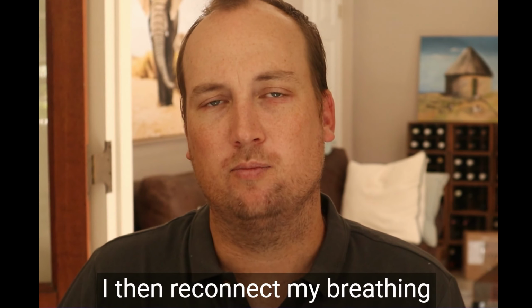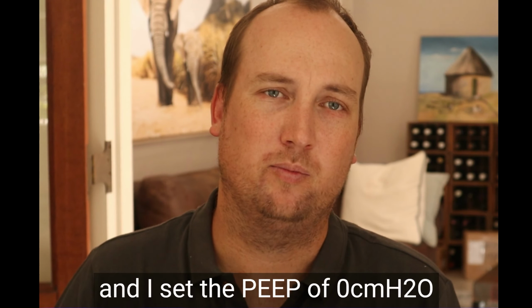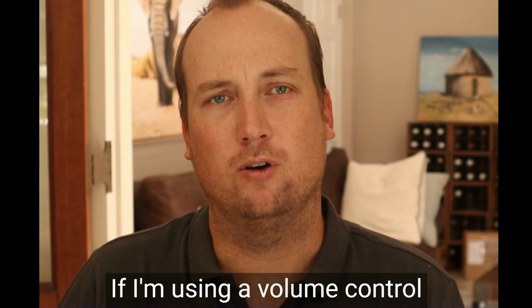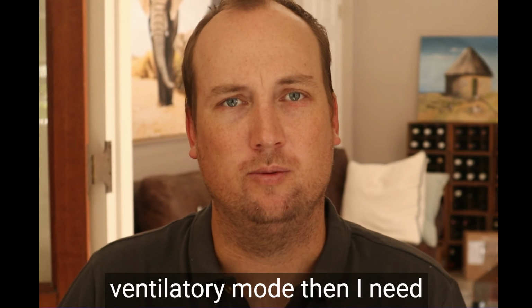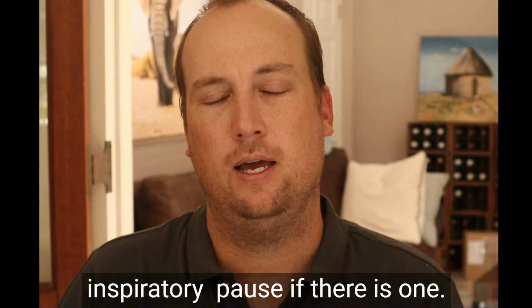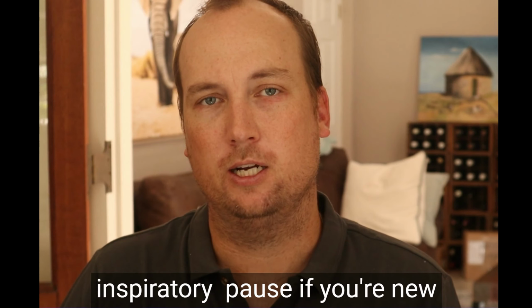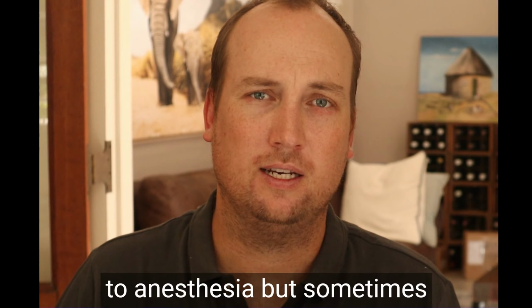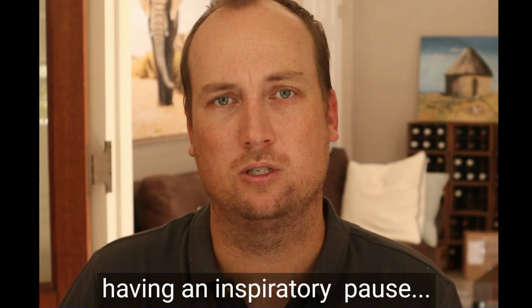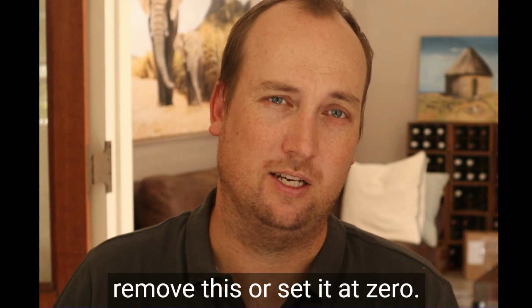I then reconnect my breathing circuit to the endotracheal tube and I set the PEEP at 0 and continue to ventilate. If I'm using a volume control ventilatory mode, then I need to make sure that I remove the inspiratory pause if there is one. And like I said, I don't recommend setting an inspiratory pause if you're new to anesthesia, but sometimes certain ventilators default to having an inspiratory pause. And so you definitely need to remove this or set it at 0.